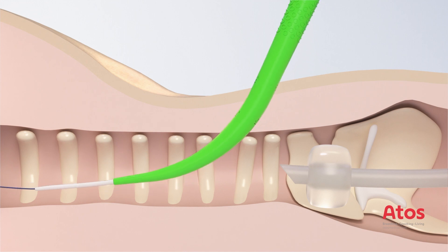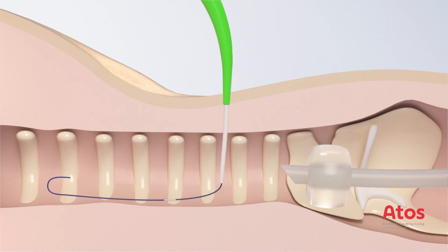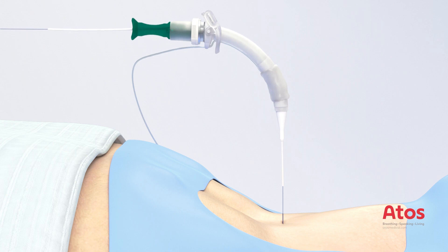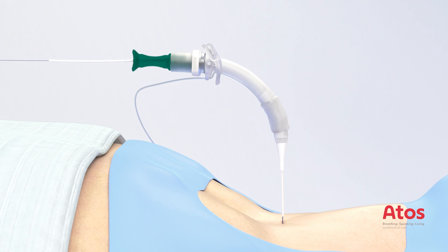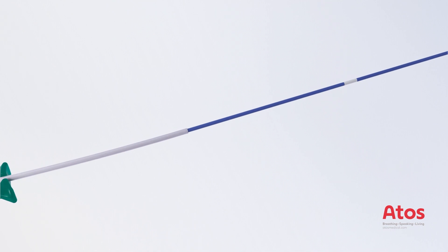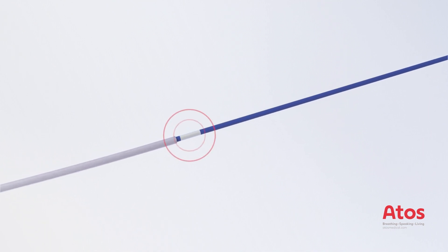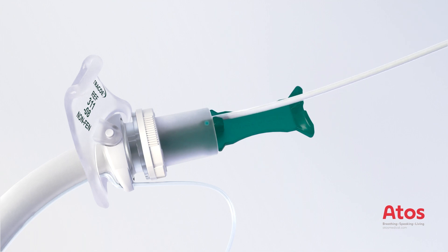For the Traco Twist Plus P tubes, the expert dilator and guiding catheter are removed after the tracheotomy, so that only the guide wire remains in the patient. Introduce the insertion system with a Twist Plus tube with pre-mounted guiding catheter onto the guide wire. Bring the tip of the insertion system to skin level using the safety stopper of the guiding catheter. Visualize the mark at the end of the guide wire.